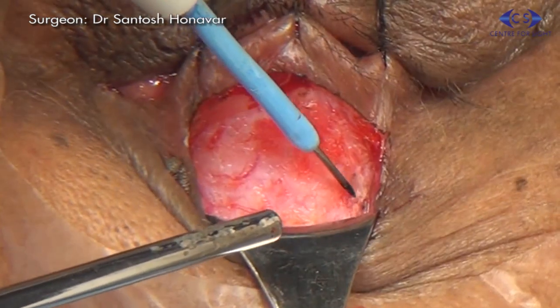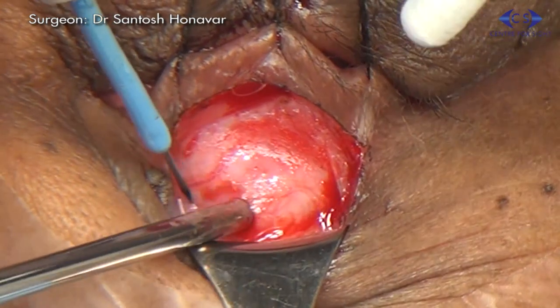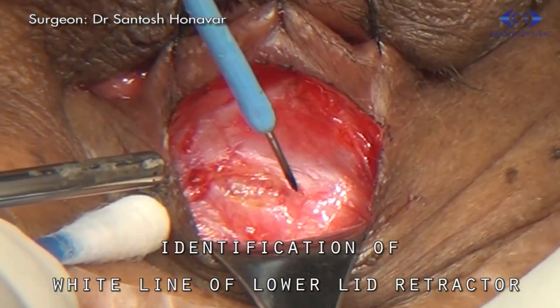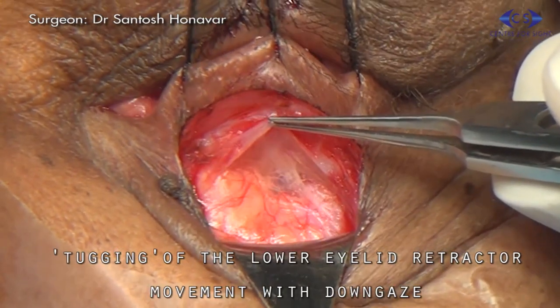The septum with the orbital fat pad posterior to it is recessed until the rolled-down upper edge of the white sheet of tissue is visible, which is the lower eyelid retractor. It moves down with downgaze and a tuck can be felt.